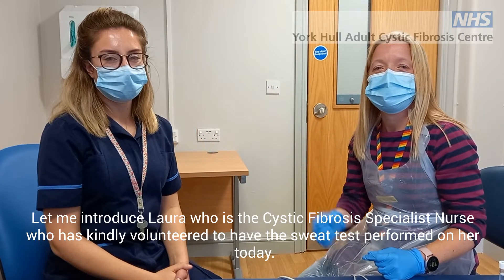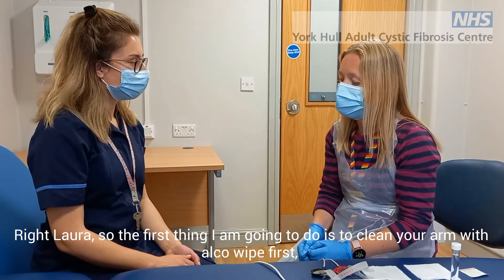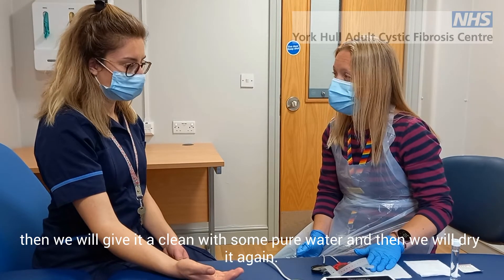Let me introduce Laura, a cystic fibrosis specialist nurse who has kindly volunteered to have a sweat test performed on her today. Right Laura, so the first thing we're going to do is clean your arm. We're going to clean it with an alcoholic wipe first, then give it a clean with some pure water and then dry it again.